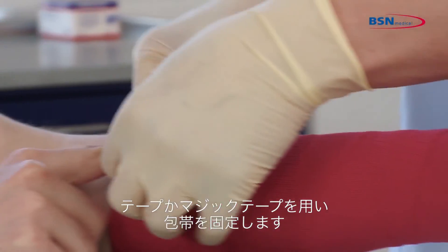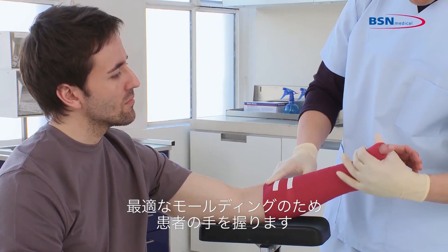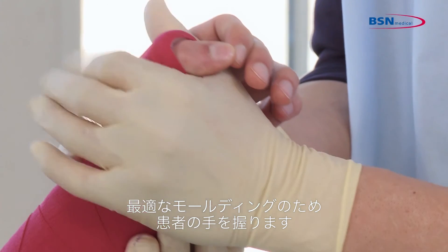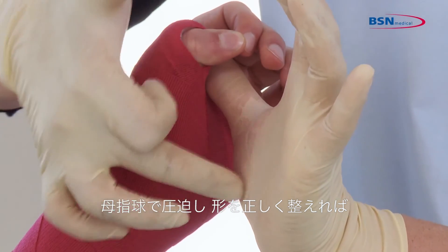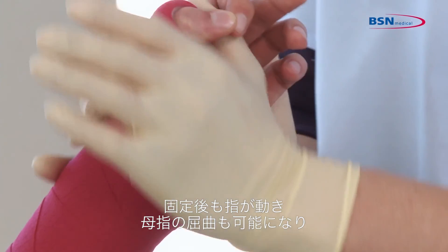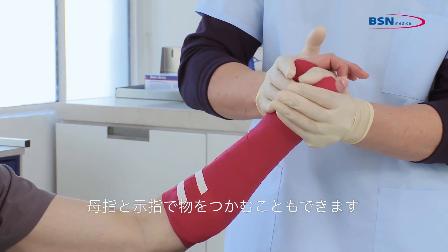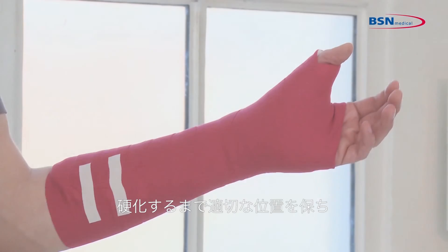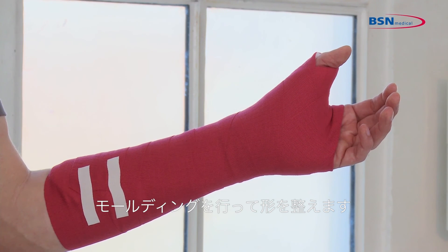For a strong immobilization, fixate the bandage with tape or a hook and loop fastener. Take the patient's hand in your hand to find the best molding position. The pressure of your palm gives the splint the right modulation so the patient is still able to move the fingers, can even flex the thumb, and move the index finger and thumb to pick up objects. Position until the splint is in a rigid position. Mold as prescribed by the physician.